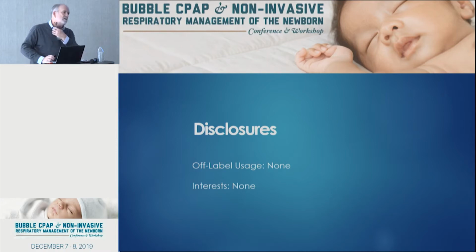I'm gonna put my glasses on so I make sure I read my notes. So the expiratory bottle, there's no magic to the plastic at the end. It's all personal preference. There was one out there you can use. I will be back there, can demonstrate, and will let you, if you're a tactile learner, touch it, put it together, think it through in your brain how you would put it together. I also have 2 examples back there of commercially available ones. That is just a personal preference or what you would like to do.